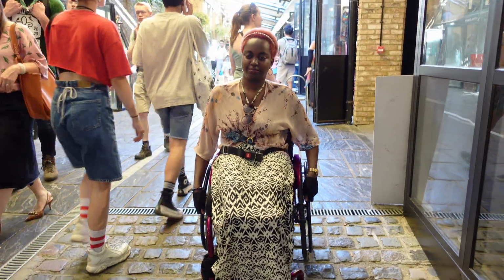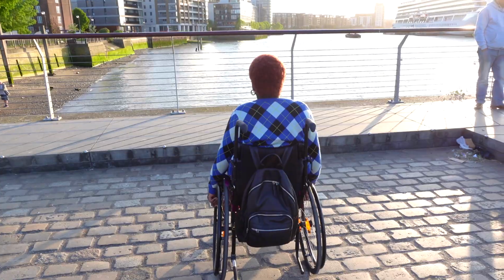What's the best thing about being in a wheelchair? My wheelchair gives me freedom to go to different places. And going down hills in a wheelchair is fun. It's also made me more resilient. The other great thing is that I can put bags or my backpack at the back of my wheelchair when I need to. But the bags can't be too heavy or else my wheelchair will tip over. This happened to me before when I had a lot of shopping.